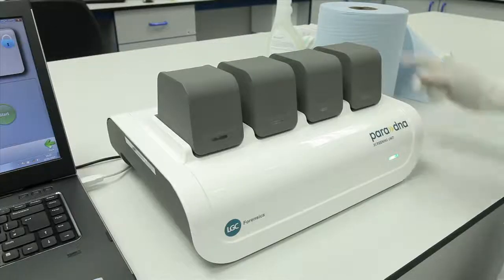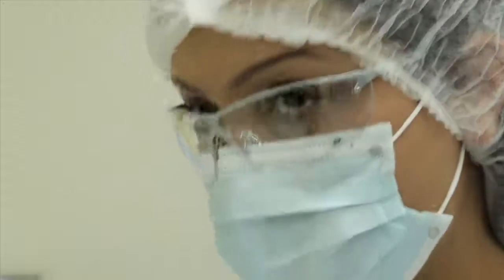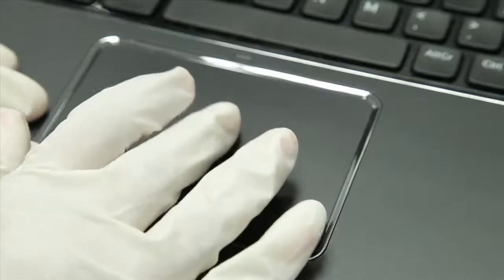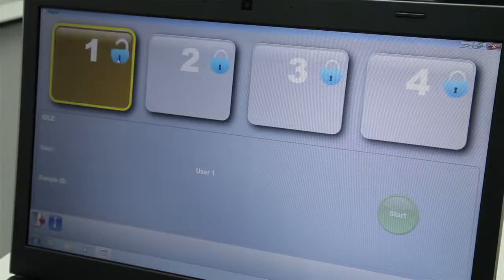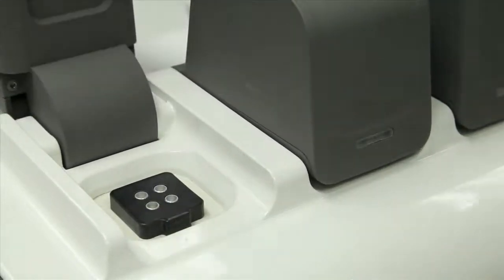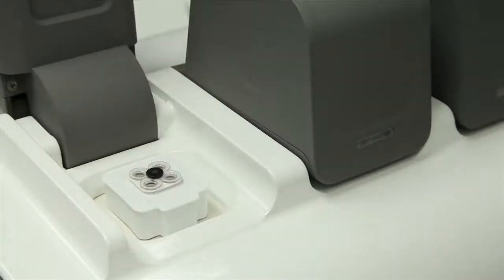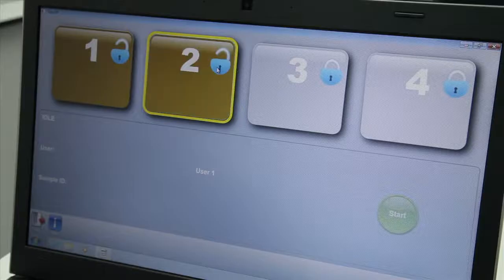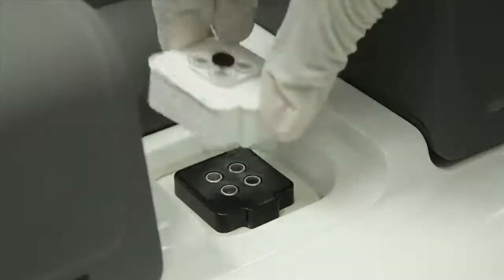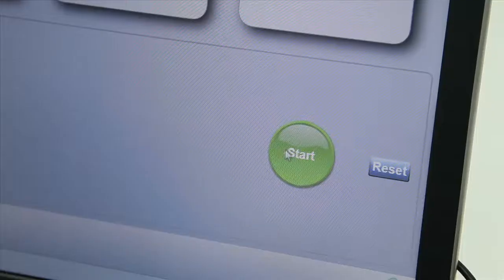The ParaDNA screening unit can process up to four samples independently. The analysis is performed by the ParaDNA screening software. Each screening head is unlocked and then loaded with the sample. It is now ready to run.